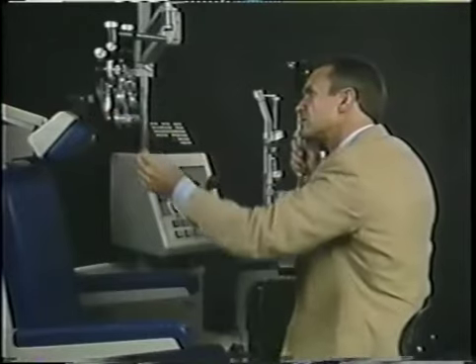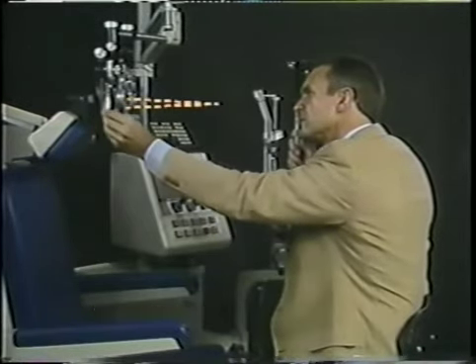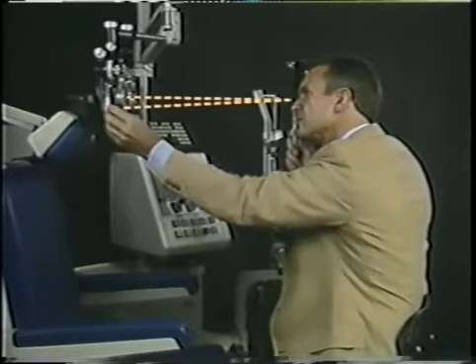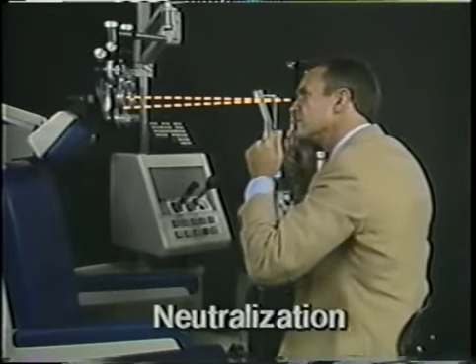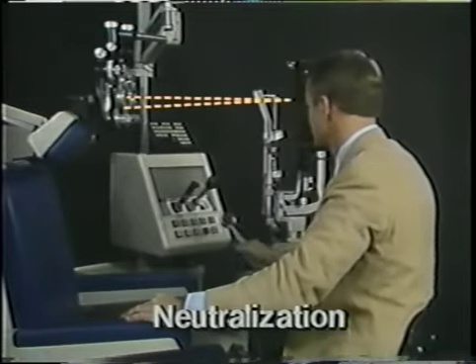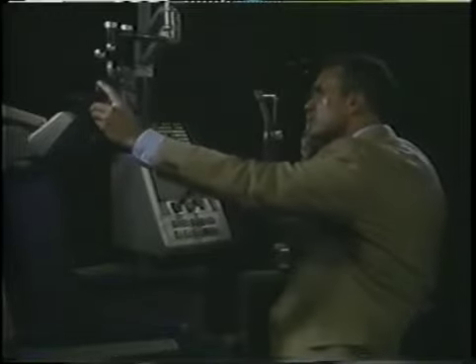If you see against movement, the far point is between the phoropter and the retinoscope, and the lenses are changed in the minus direction by dialing up to move the far point out to the retinoscope. When the far point reaches the retinoscope, the reflex becomes neutralized, filling the whole pupil and no longer moving. Dr. Guyton will look at a reflex and move the far point around by changing the lenses.